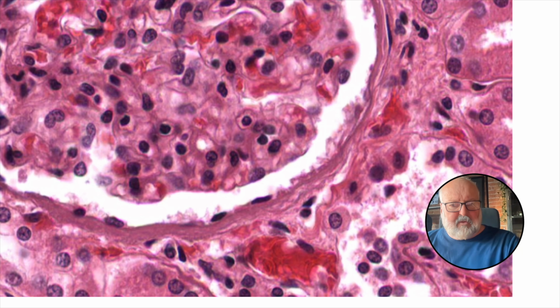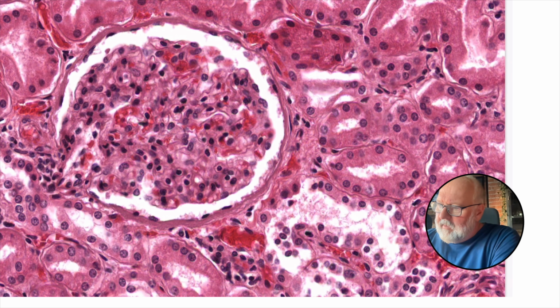Now we've got to figure out the second name, which is based on cell shape. And the cells look quite flattened. The nuclei are quite flattened. The cells are flattened. So this would be simple squamous epithelium. Right? So there we go. Now, there's a second type of epithelium here. Have a look around for a second. See if you can see it.